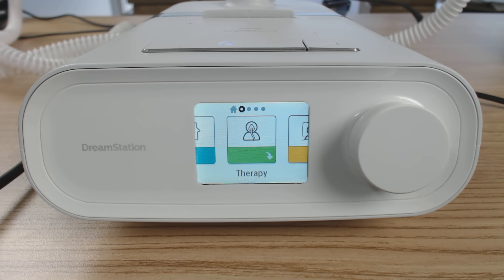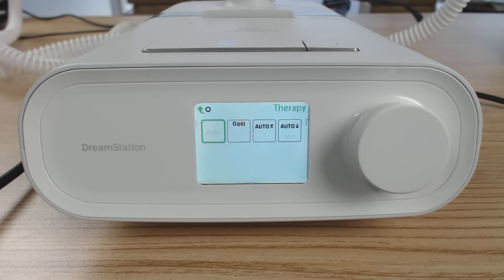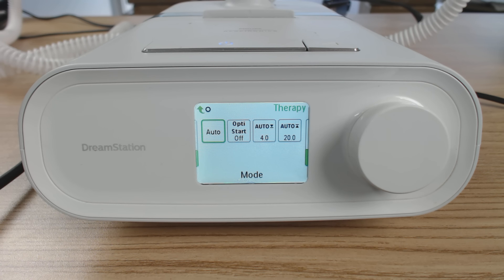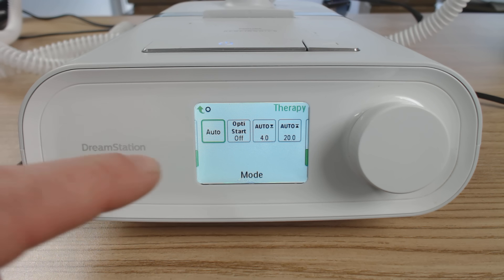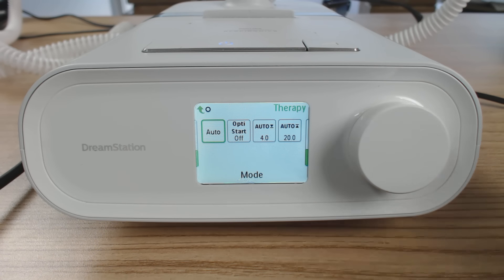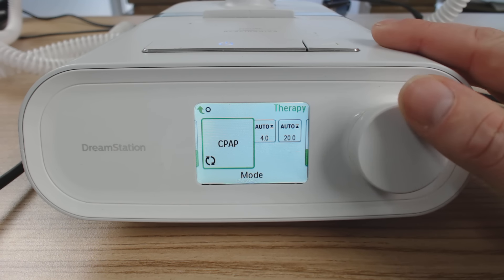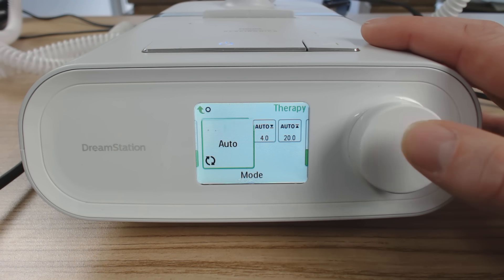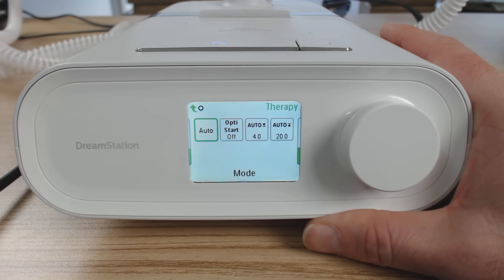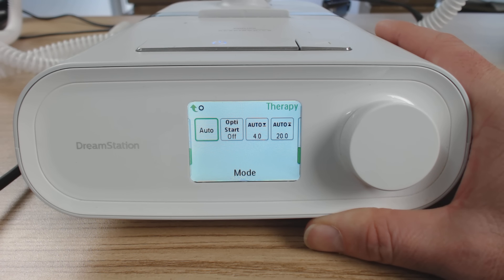Now we have access to the clinical menu, and the first thing that comes up is therapy. If we click the click wheel in, it takes us into the therapy section. The first part here is the mode — you can see this is set to auto. If you've got an automatic machine, it should pretty much be set to auto. If you've got a fixed pressure machine like a CPAP, it'll probably only give you access to CPAP mode. Because we've got the automatic machine, we can run it in auto or CPAP modes, but we're going to run it in automatic mode.